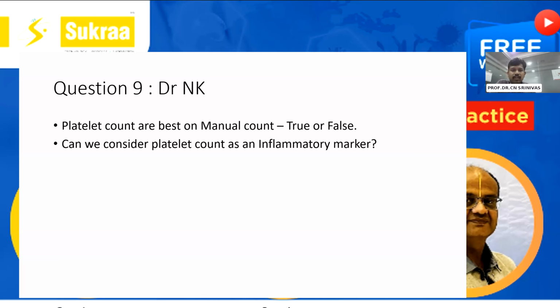Srinath sir, do you have anything else to add? That's good, doctor. You are reinstating that the platelet counts are best from the analyzers if the QCs have been through, and we have to rely upon that. And the most important point you brought out is right, the pseudothrombocytopenia which we encounter with the clumps. And if there are many, then the collection should be tackled.